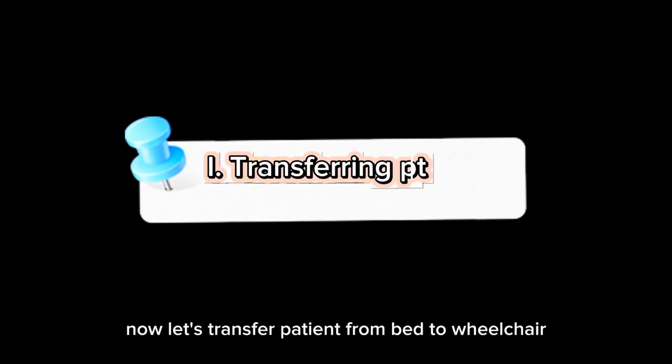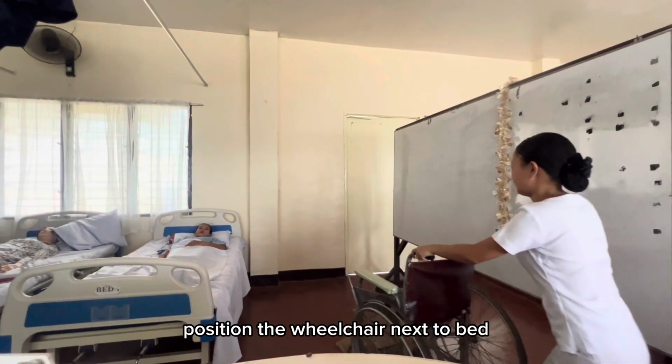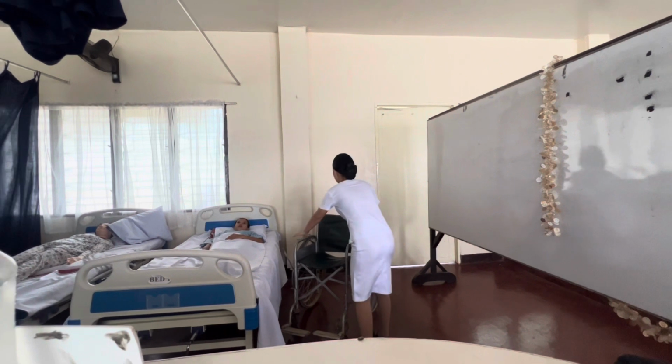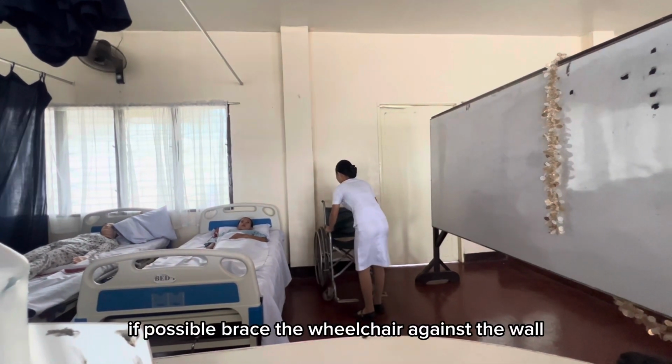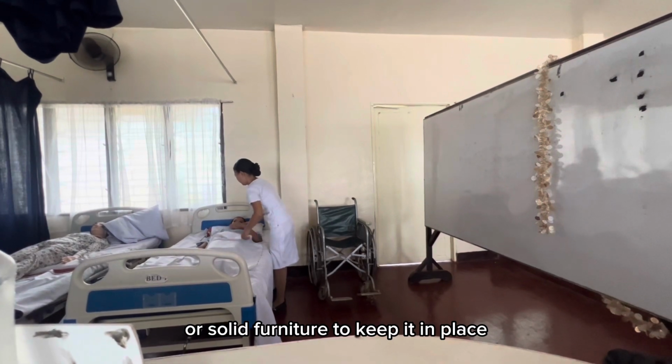So now, let's transfer the patient from bed to wheelchair. Position the wheelchair next to the bed facing the foot of the bed. If possible, brace the wheelchair against the wall or solid furniture to keep it in place.